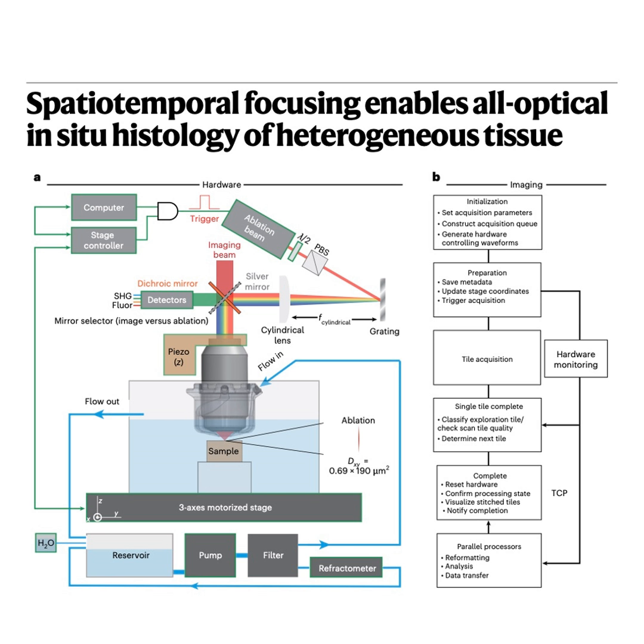And it was stable enough. Incredibly stable. The data shows that over a 96-hour continuous run, this feedback loop maintained the refractive index with a coefficient of variation of just 0.000016. That's astonishingly stable. Basically negligible drift over 4 days. And that level of automated stability control is absolutely fundamental to making multi-day, autonomous, high-precision histology possible.